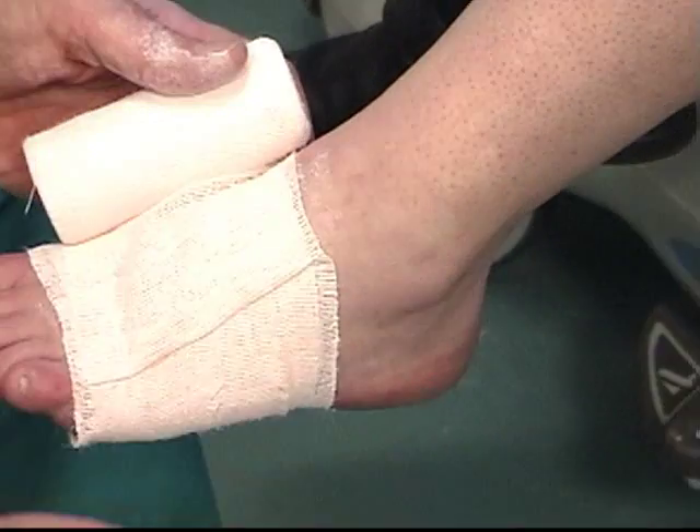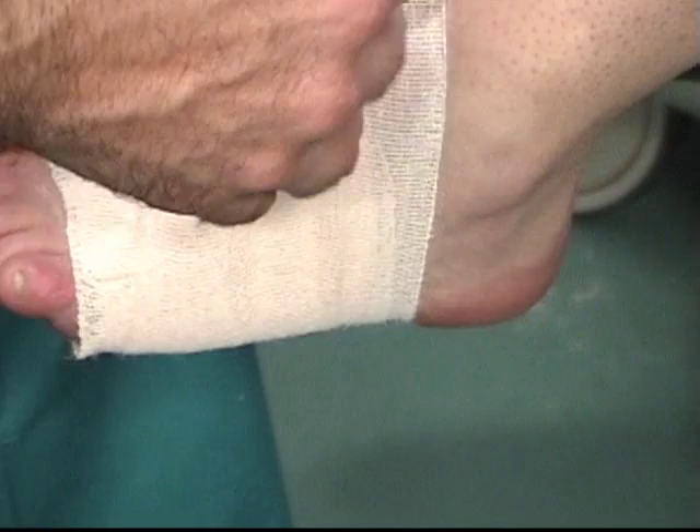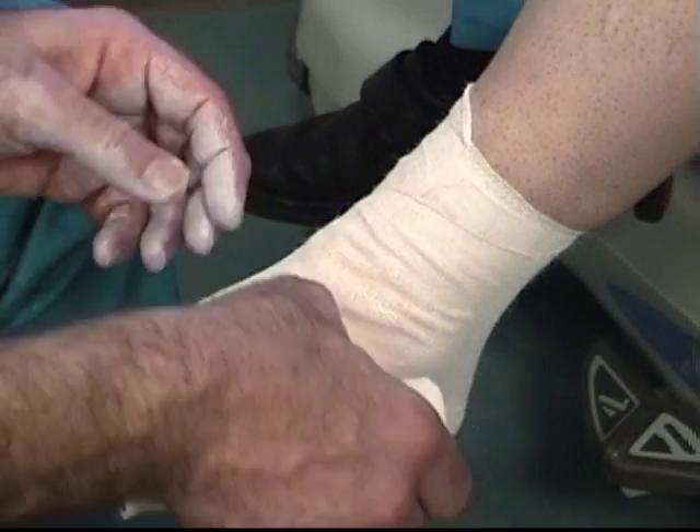Place the Unaboot material directly against the skin, wrapping it on the leg. If there are open ulcers or lesions on the foot or lower leg, one must ensure that the Unaboot covers them well.